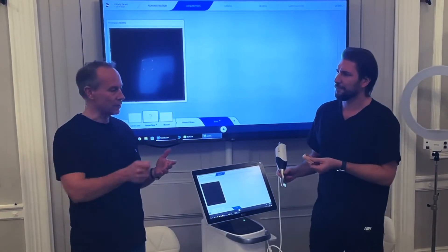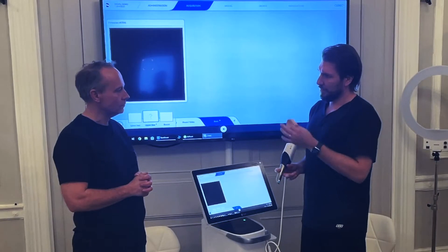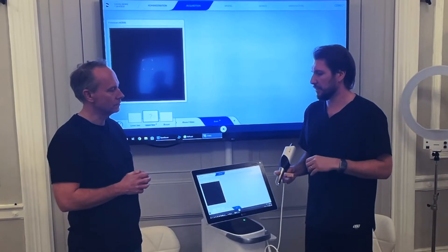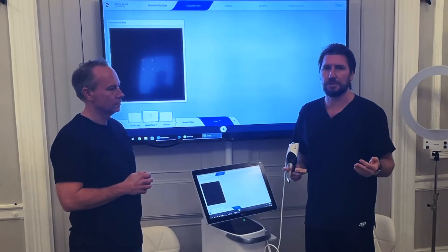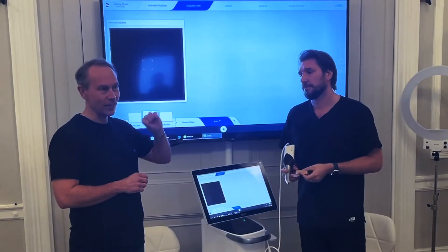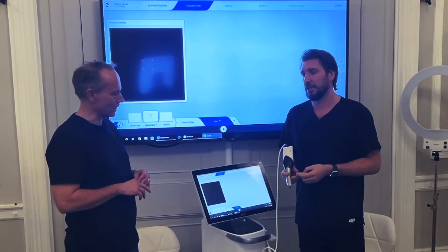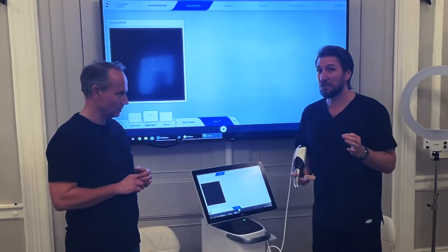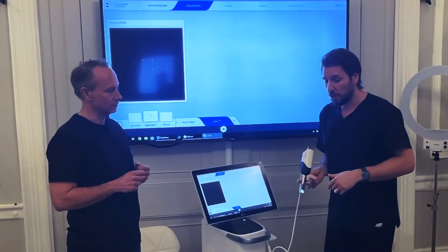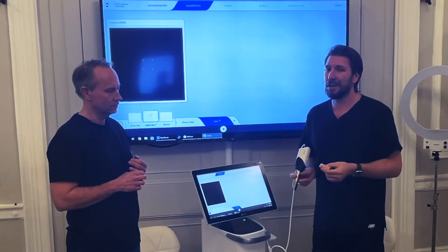As usual, have the patient opening wide, sitting up properly, nice and dry — the nurse should apply a little air and suction. Keeping it dry is really important because fluid will reflect off the scanner; a bubble of saliva or blood sitting in the margins will affect your crown margin later. Make sure you have good moisture control and move your finger around as you take the scan.